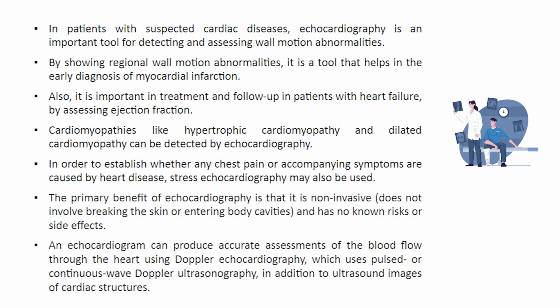Also, it is important in the treatment and follow up in patients with heart failure by assessing ejection fraction. Cardiomyopathies like hypertrophic cardiomyopathy and dilated cardiomyopathy can be detected by echocardiography. In order to establish whether any chest pain or accompanying symptoms are caused by heart disease, stress echocardiography may also be used.